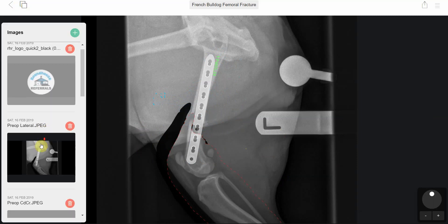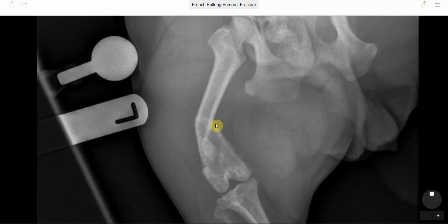On the caudal cranial view, you can see the nature of the fracture and where it was located.